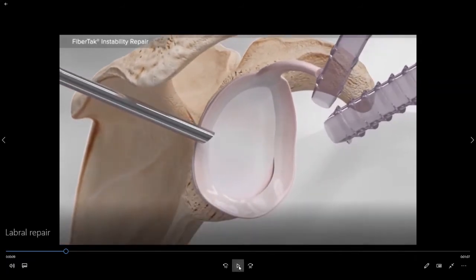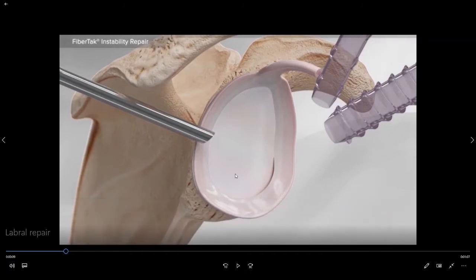So this is the socket now. The socket is the end portion of your shoulder blade. You can see the shoulder blade back behind the socket. The socket is covered with articular cartilage which is the soft rubbery stuff on the end of a chicken bone. If you break open a chicken bone you see that glistening articular cartilage. But there's a specific type of cartilage called the labral cartilage that lines the rim of the socket all the way around.